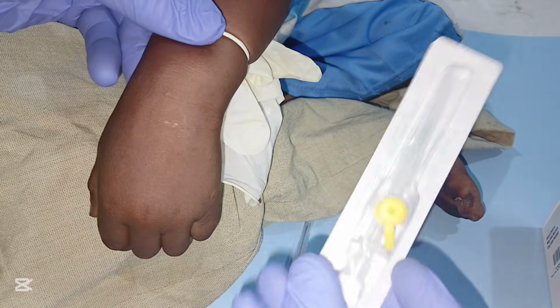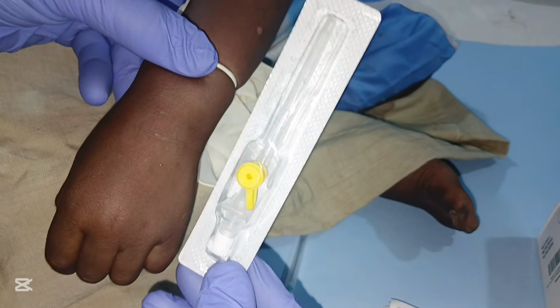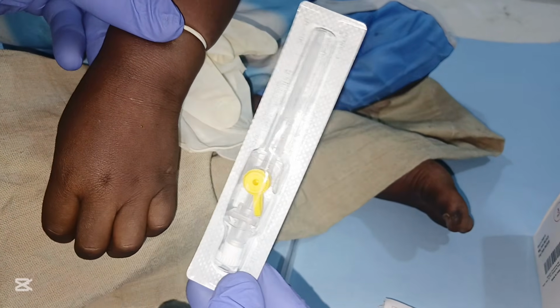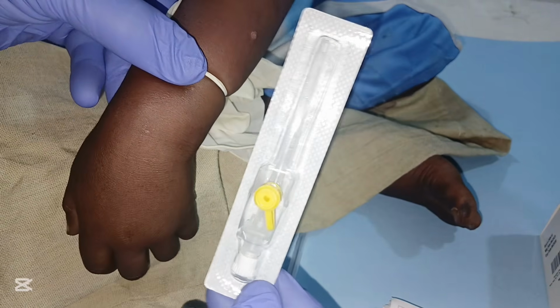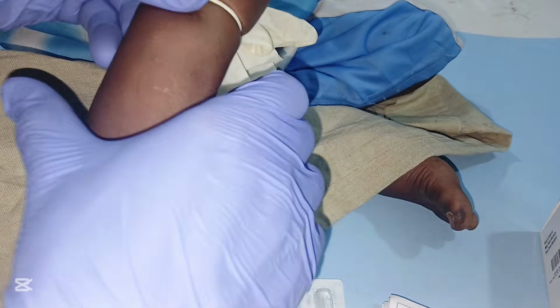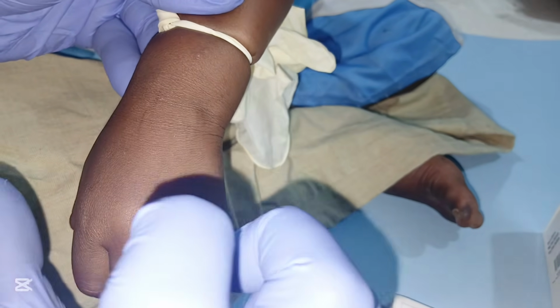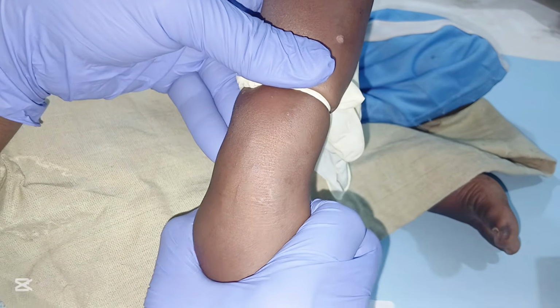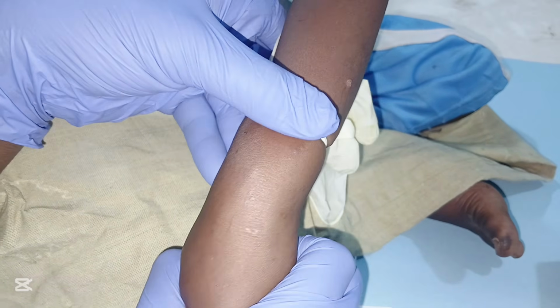Number two mistake is not selecting the right size of the cannula. A 24 gauge cannula, the yellow one, is the preferred IV insertion size for pediatric patients. Make sure you select the right and appropriate size of IV cannula. Another mistake is not following the right direction of the vein when you insert the IV cannula into the vein. So these are the main mistakes why you are failing to perform pediatric IV insertion technique.